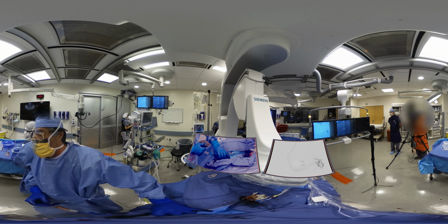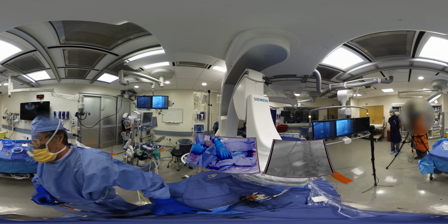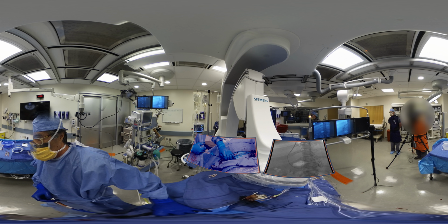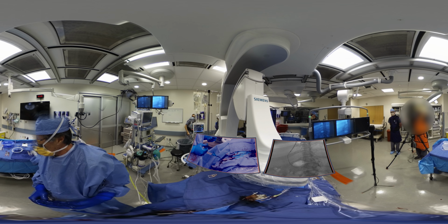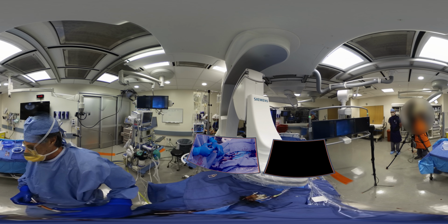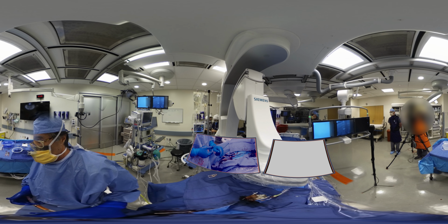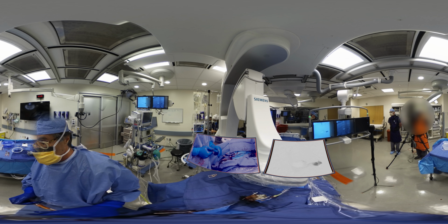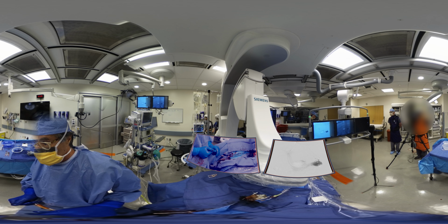All right, so you see that I'm in some small gastric branches, and it's always while I inject lightly at the beginning. Even if I had free flow a moment ago, I'll always inject lightly, because the patient may breathe down into the catheter, and then you can actually do some serious damage by over injecting something small. So I'll start small and slowly increase during the injection.